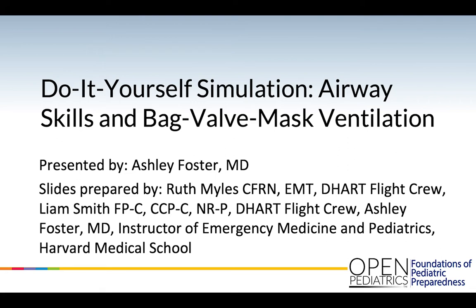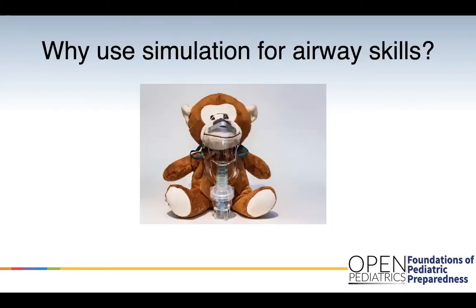As Dr. Albrock highlights in the introductory PowerPoint presentation, using simulation as a teaching tool can be incredibly valuable and does not require expensive simulator models. For children, the etiology of arrest is much more likely to be from a respiratory cause than a cardiac cause. Because of this, knowledge, comfort, and competency in managing the airway becomes critically important. Critical illness in children is much less common than adult critical illness, which may mean less opportunity for providers to manage a pediatric airway. Simulation can help bridge this gap and arm the pre-hospital and emergency team with skills to successfully manage a pediatric airway when needed.